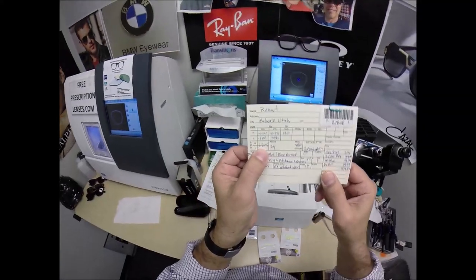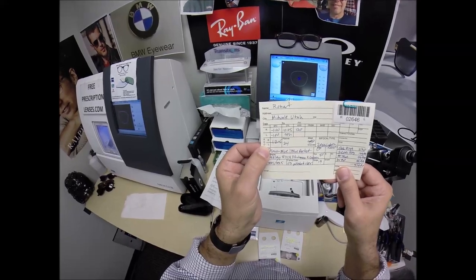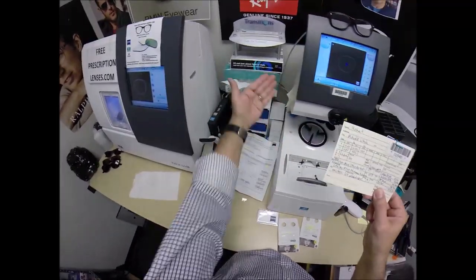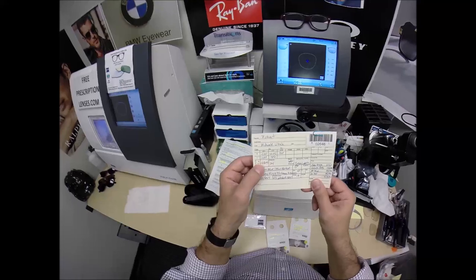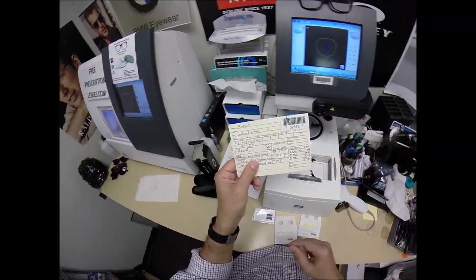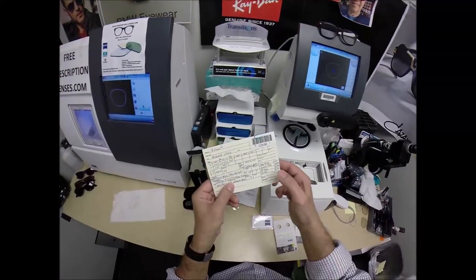Now, your bifocal strength, the add, is called the add because it means in addition to what's on top. So you pretty much can read with your glasses off. It's just once everything gets beyond arm's reach, you have trouble seeing that. So he could get by with single vision glasses and then take them on and off to read, but that gets old after a while. So most people just say, give me something I wear the whole time.